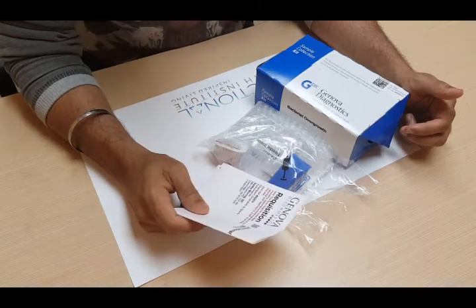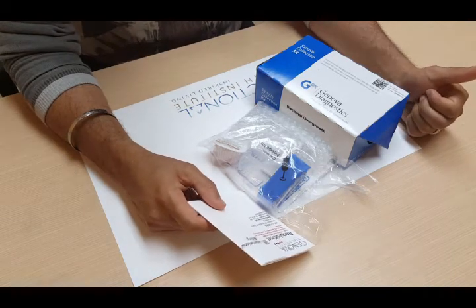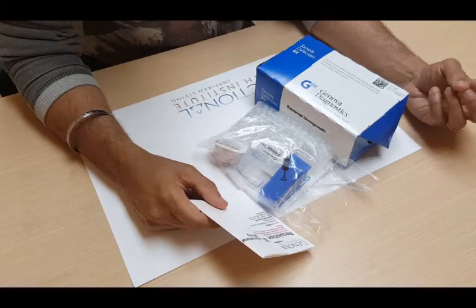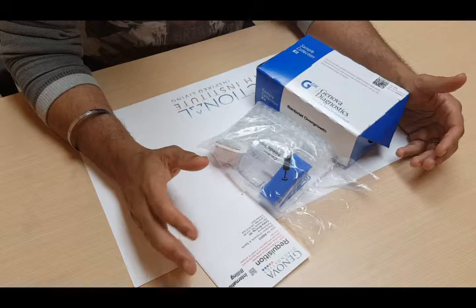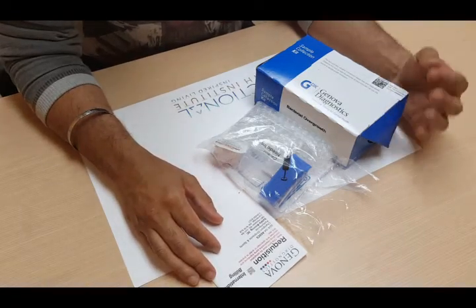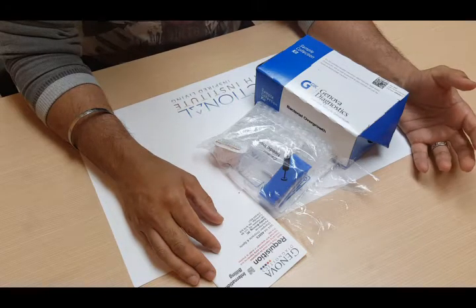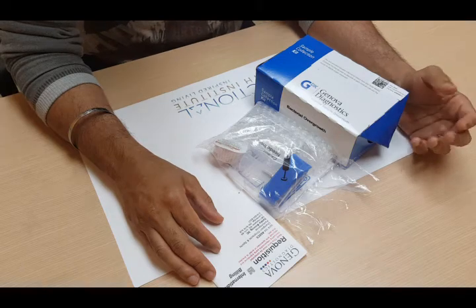Before I get into how to actually do the test collection, I want to go over some things that you have to consider before you do the test. Basically, if you have an acute infection or viral illness or anything like that, you shouldn't do this collection until you're feeling better. You want to wait at least four weeks from the time of doing a colonoscopy or barium enema to do this test.